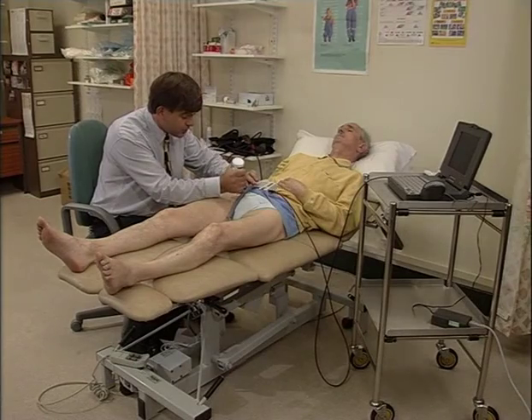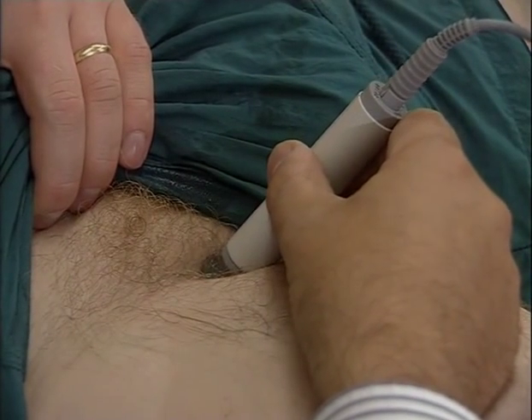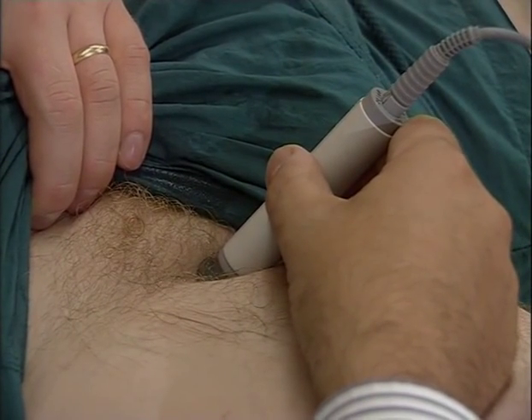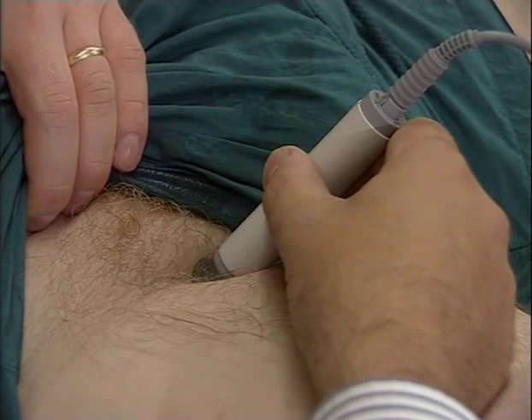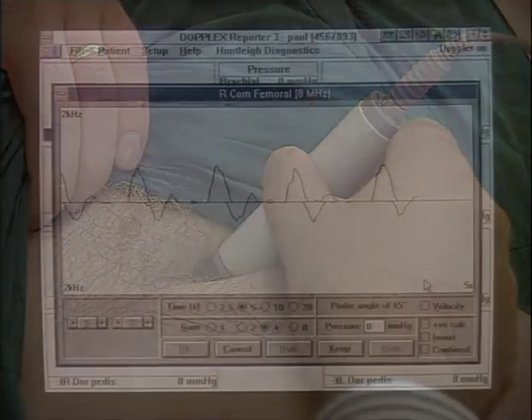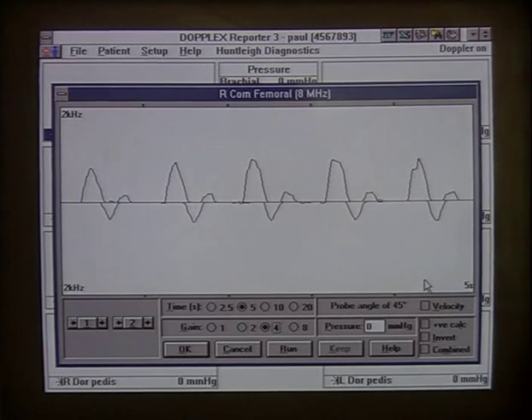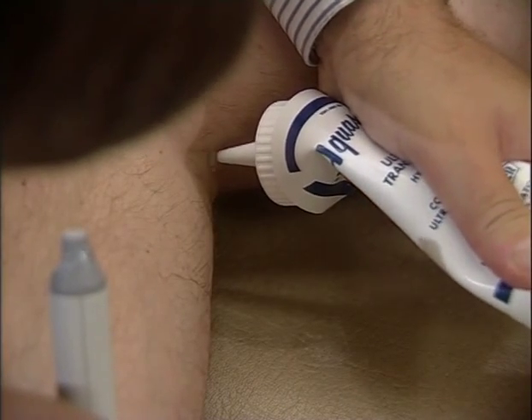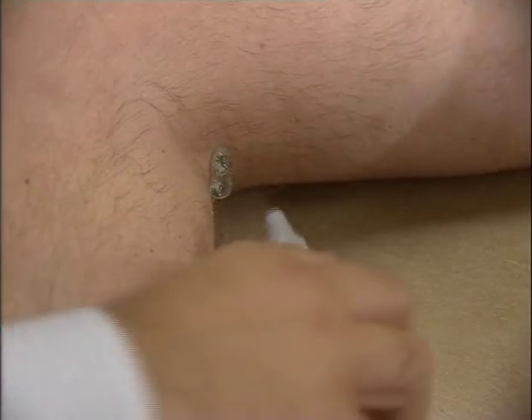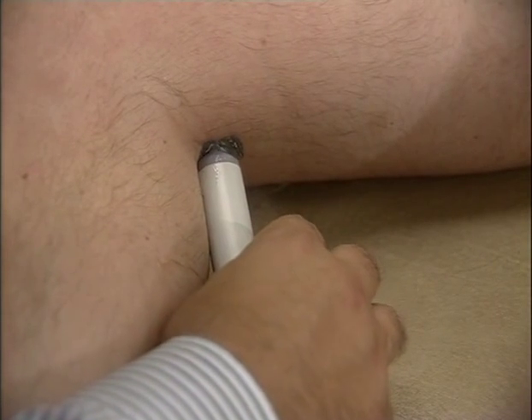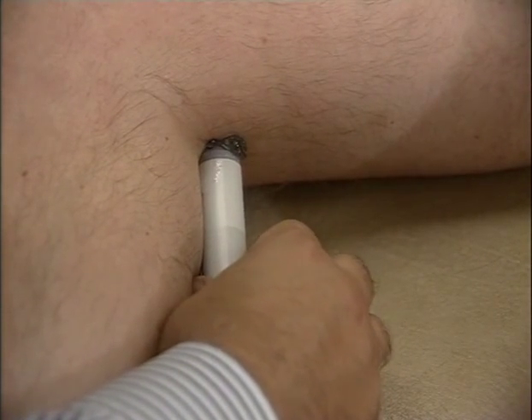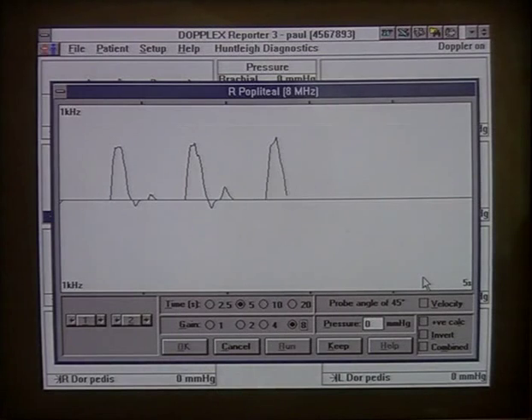For arterial examinations, the patient lies supine. Locate the common femoral artery in the groin and move the probe gently until a strong clear signal is obtained. A normal common femoral artery will typically produce a biphasic or triphasic signal: an initial systolic forward flow, a reverse flow phase, and a small forward flow phase before the next cardiac cycle. The popliteal artery may take a little time to locate. Place the probe behind the knee and move medially until a strong signal is obtained. Again, a triphasic signal is typically found in healthy legs.